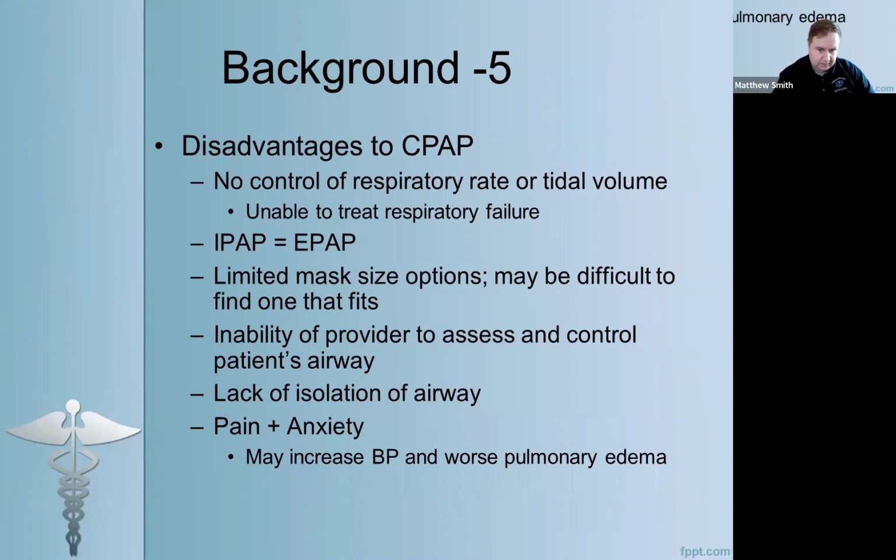There's no such thing as an expandable mask that we can expand and contract to fit perfectly. And so if one of the mask sizes that we carry doesn't fit the patient, or if none of the mask sizes that we carry fits the patient, then you can't do this, you can't use CPAP.